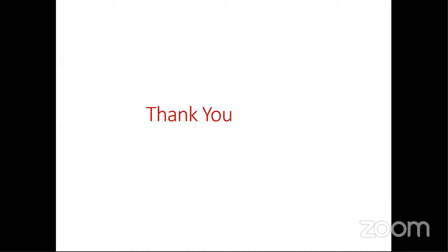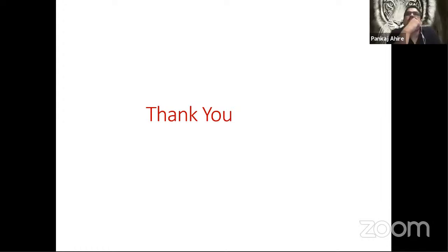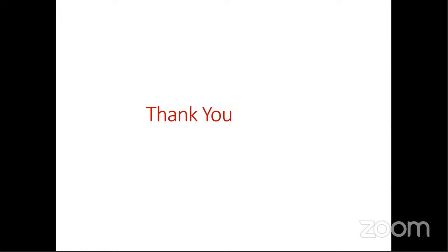The second thing is, we learned in an era where our teachers taught us to reduce most of the things closed. Way back in 1984, 85, 86. So we are geared up with that technique. That probably mattered a lot in our life and our experience. And depending on the fracture anatomy at reduction, then we decide what wires are to be put. Sometimes we put subchondral wire first, then fix the radial side. Sometimes we put the radial lateral wires first, dorsomedial wire, and then we put the subchondral wires. But that entirely depends on the geometry after reduction and putting the assembly.